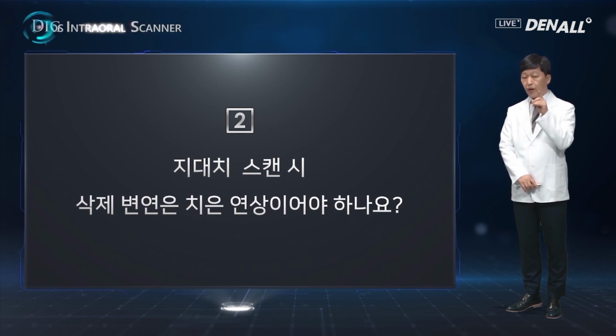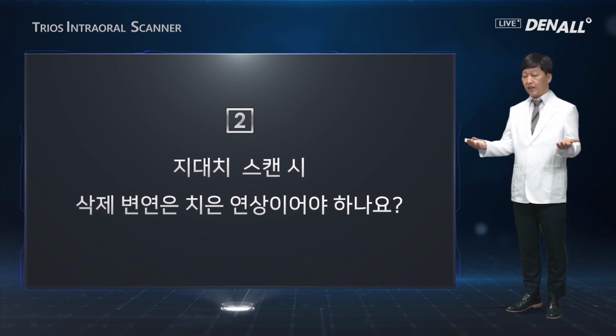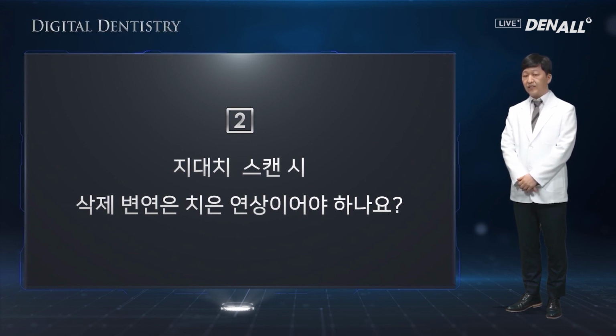As long as the margin is dry and is visible, the margin can be accurately read. So it doesn't have to be supragingival margin. So this question is irrelevant. Among the scanners, especially Trios 3 or Trios 4, can accommodate submargin as well.